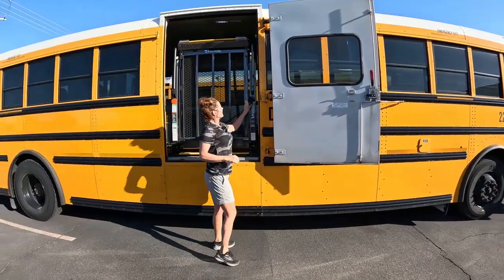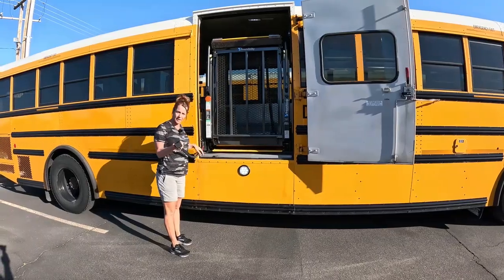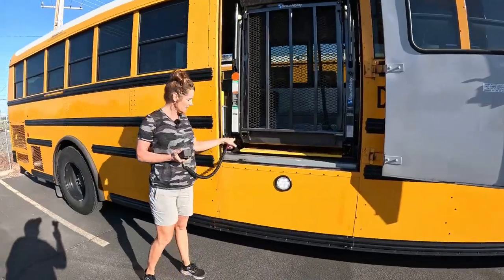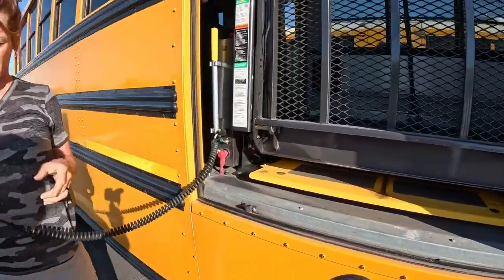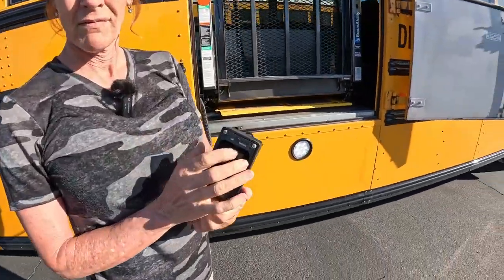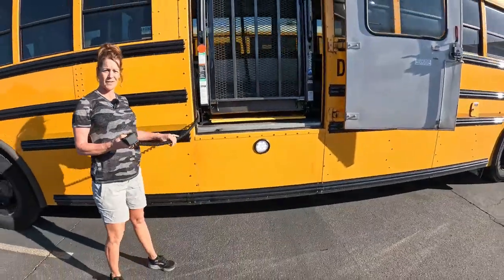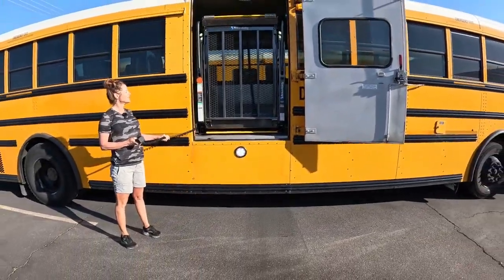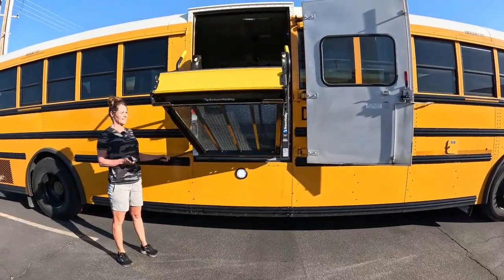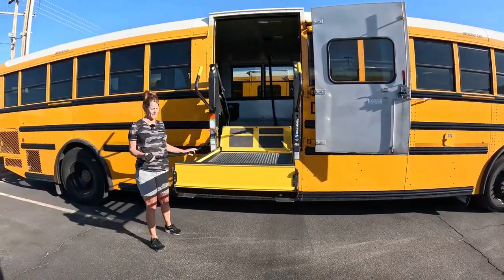You have your up and down controller. Right here you'll have your on and off switch. Just make sure that it's turned on. You'll have your up and down and your fold and unfold. So we're going to want to unfold it first. And then we're going to bring it all the way down.